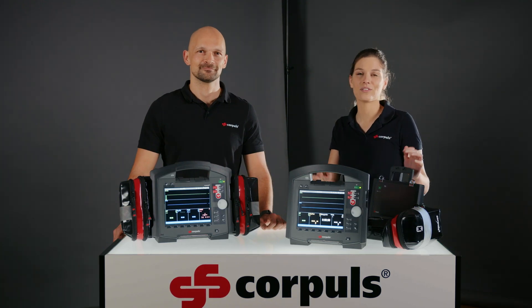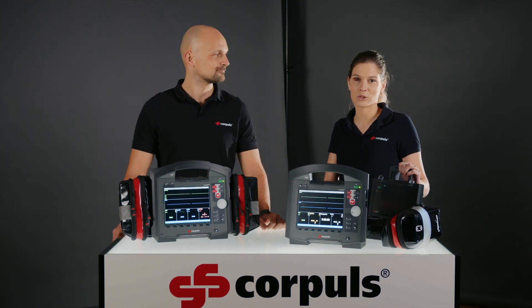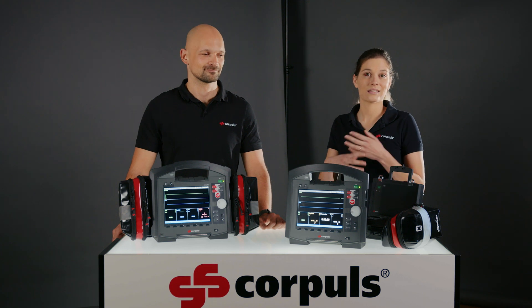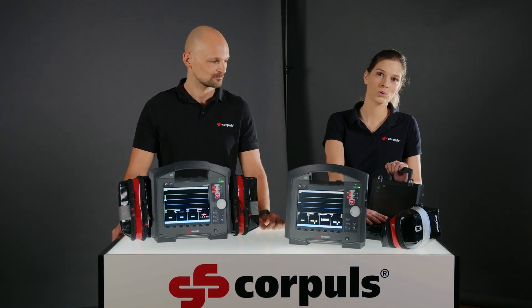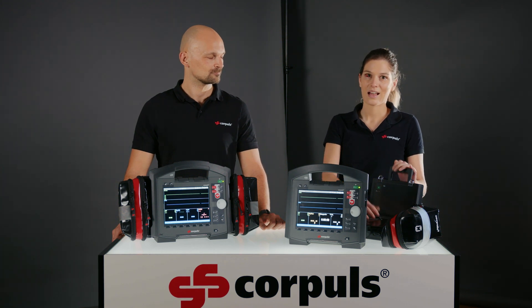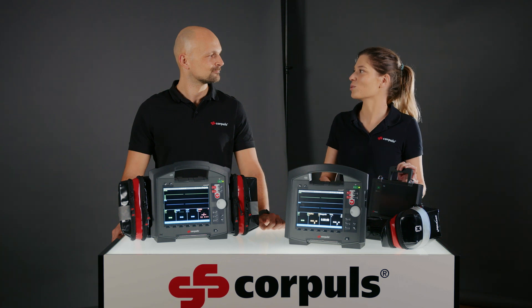Hi, welcome to a new video. Today we want to look at the modular structure of the Corpulse 3T. The device can be divided into three different parts, giving you the display, the patient module, and the defib module. Andy, could you tell us a bit about using the Corpulse 3T in compact mode?